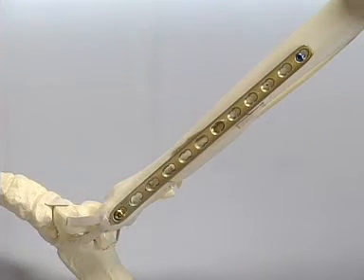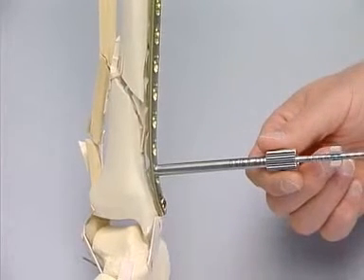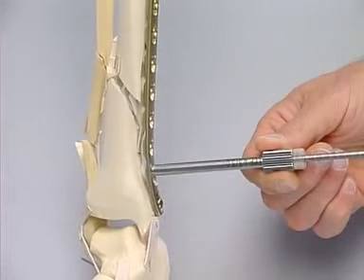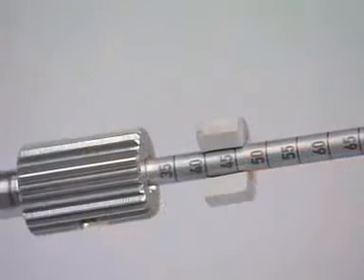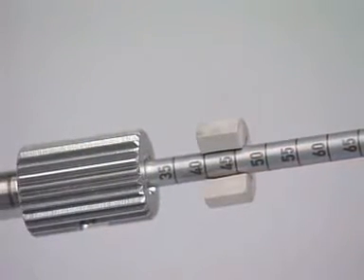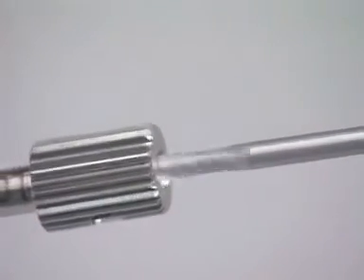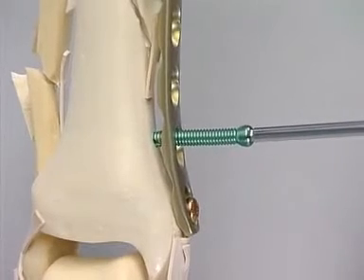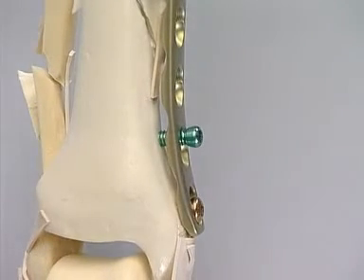The further stabilization is carried out entirely with locking head screws. In the metaphyseal section, green self-tapping screws are used, for which holes are drilled with the 4.3 mm drill bit through a threaded LCP drill guide. The length of these screws can be read off on the scale after the drill is slightly withdrawn. The selected screw is inserted with the air drive. Here too the last few turns are carried out with the torque-limiting screwdriver.